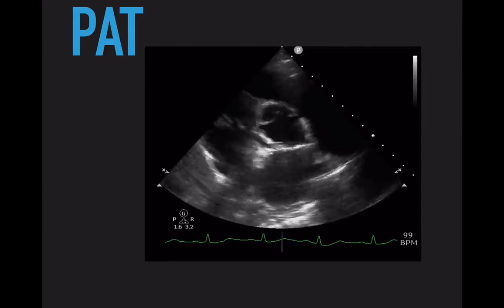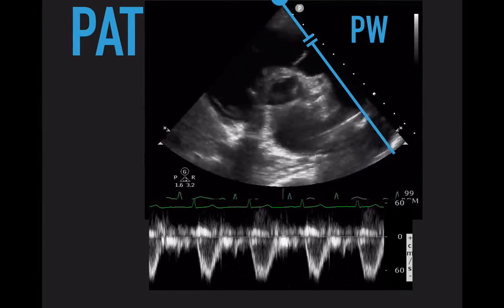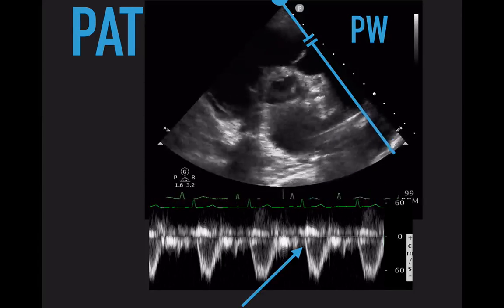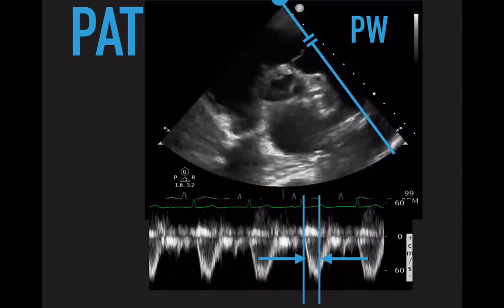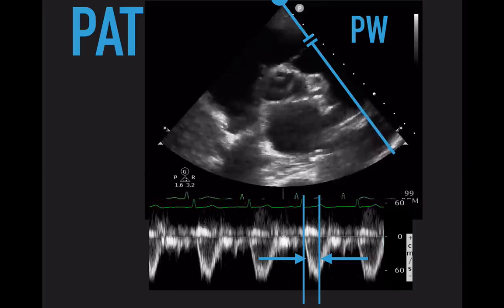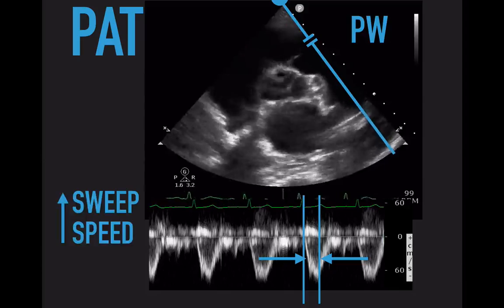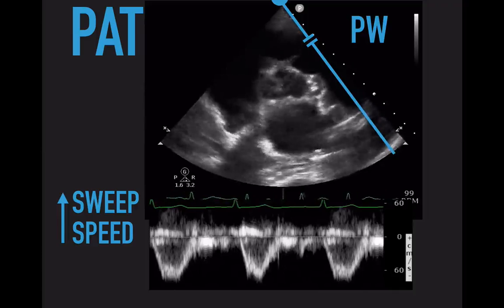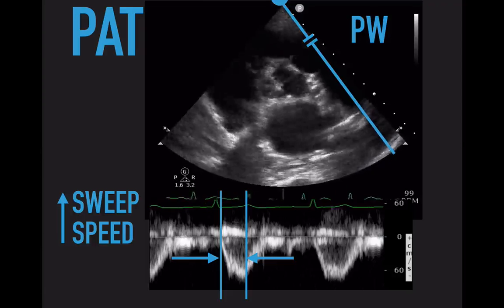Once you have your view, hit the pulse wave button and put the sample gate just on the RV side of the pulmonary valve, right in the middle. Hit pulse wave again and you end up with swaths of blood flow. You're going to measure from the beginning of the blood flow to the peak velocity — that time is your pulmonary acceleration time. If you increase your sweep speed as high as it'll go, it stretches out those swaths, making it much easier to measure from the beginning of flow to the peak.